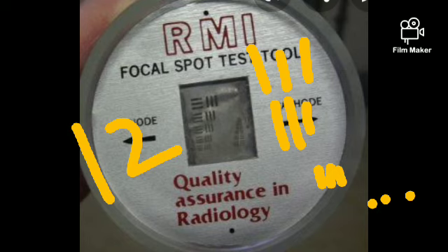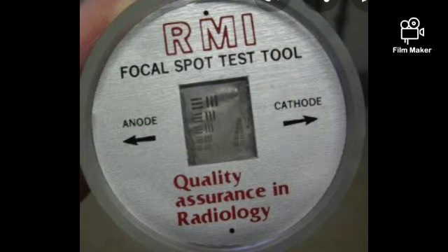The higher the number, the better the image quality you will get. As per the image, you can have bar patterns from 0.84 line pairs per mm to 5.6 line pairs per mm.